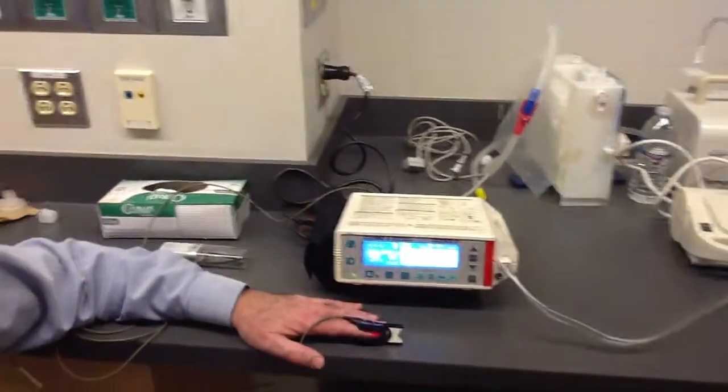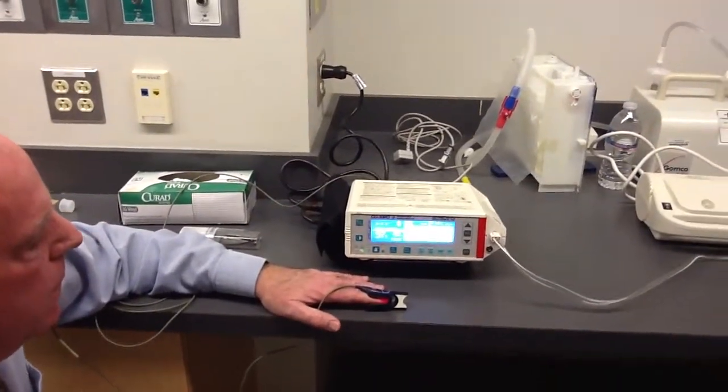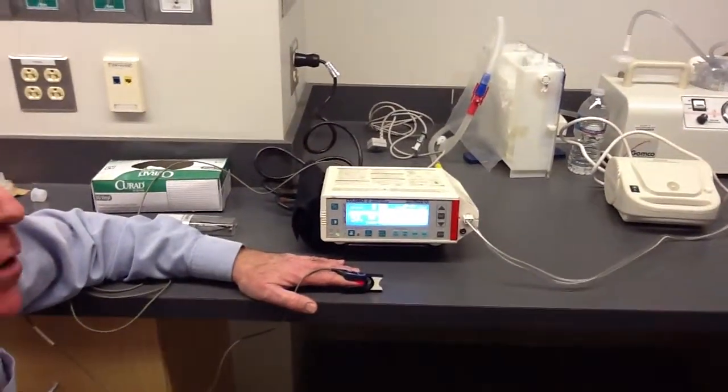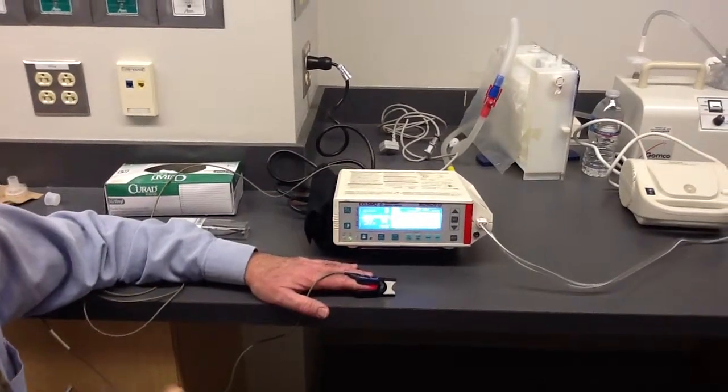Yes, I believe it. Why? Because it measures the wavelength. Okay. But how do you know that the machine is accurate? The issue is always: is the machine measuring accurately?